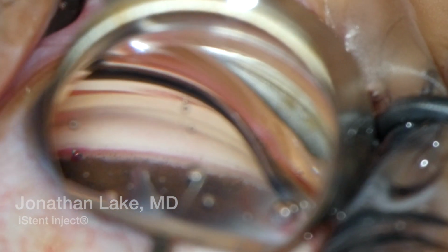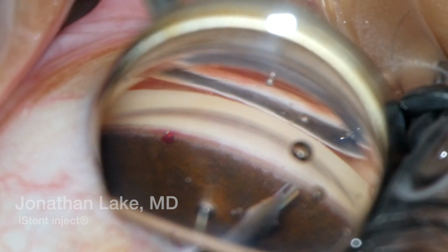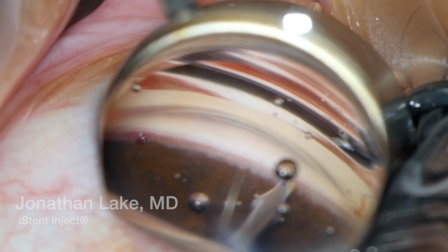We will implant the second stent. Here I'm looking for the other collector. And here we'll aim the trocar to the trabecular meshwork. And I have to apologize because that bubble right now will move right in front of the implantation.